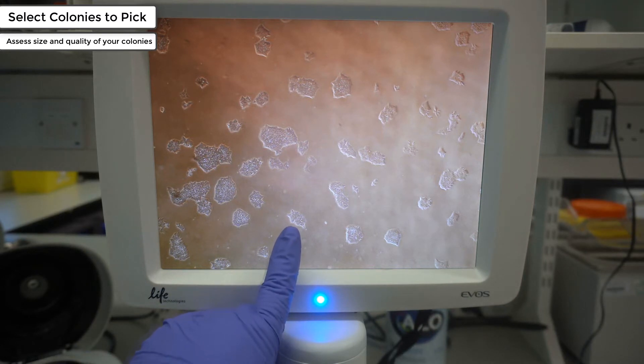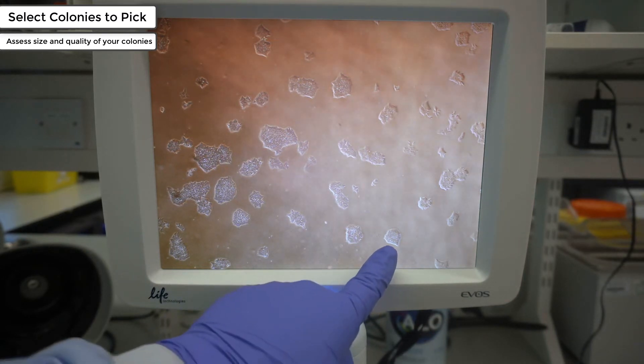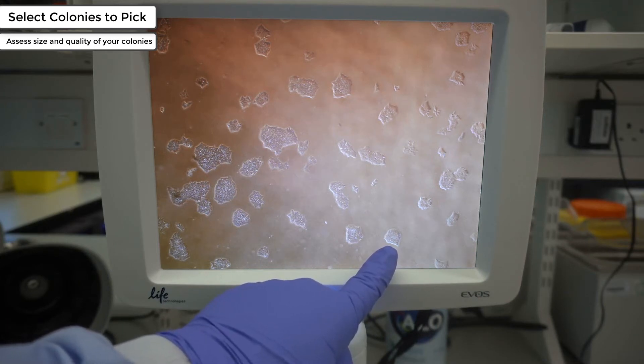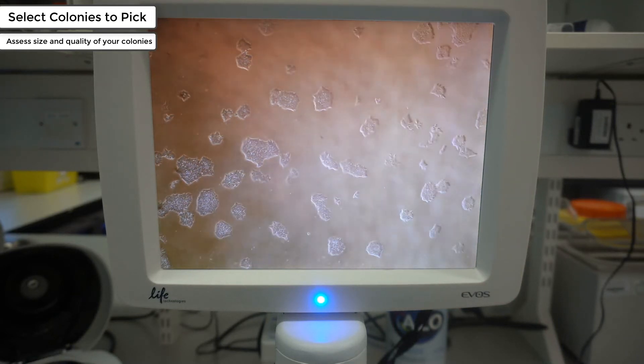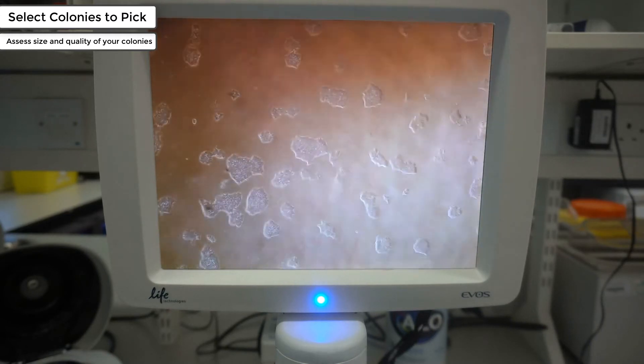As an example of spiky and ill-defined edges — this other colony, even though it has a spikier edge, will be selected for colony picking. The spikiness observed is probably due to the way the colony is currently growing and not because it has a differentiated edge. This image is also a good indication of the difficulties you might encounter while working with reprogramming, due to the number of colonies growing in such close proximity, making it difficult to work clonally. It is recommended that you look around the entire plate before selecting your colonies.